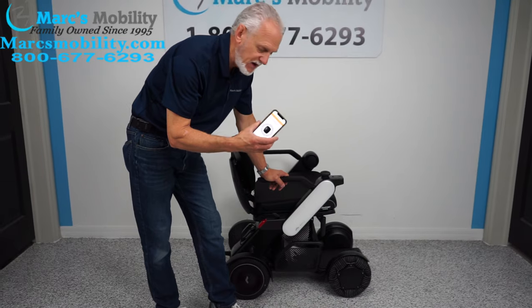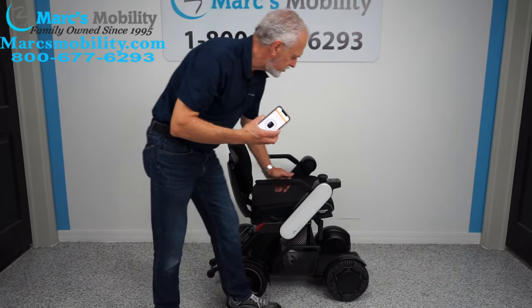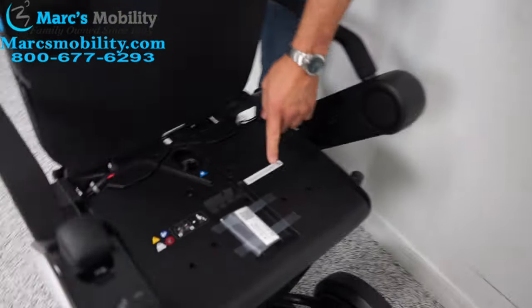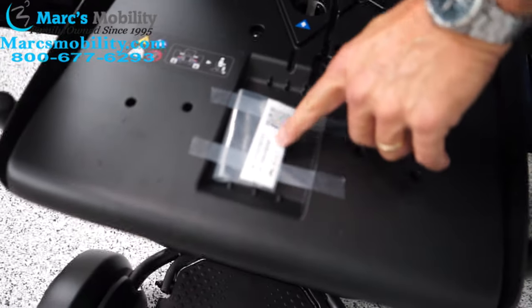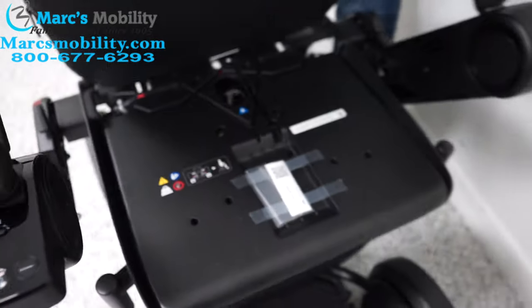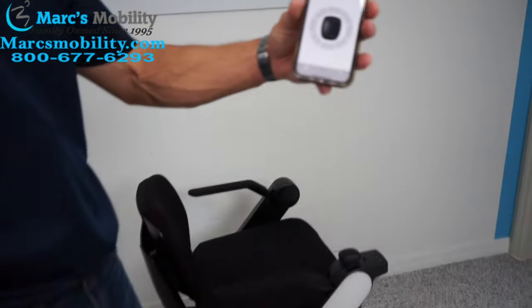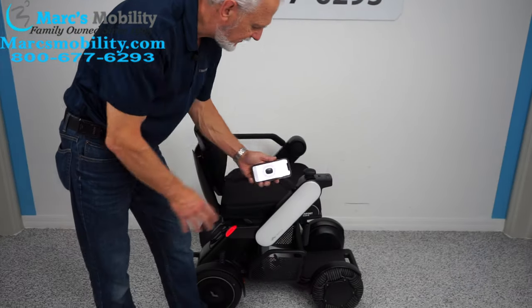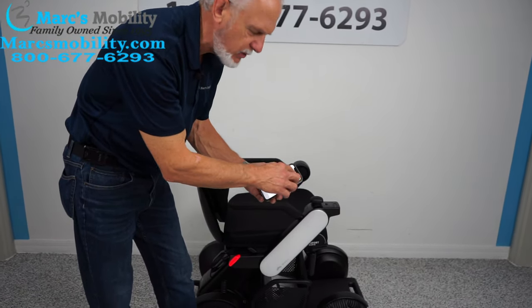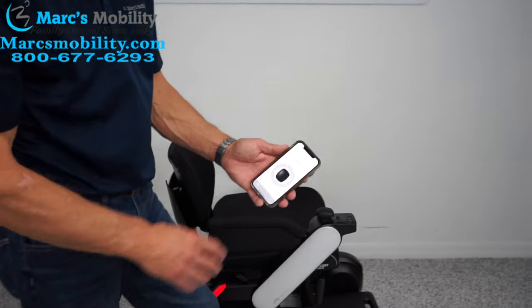If you want to drive this chair with your cell phone, you'll download an app. There's a code number under the seat — a sticker sitting in a square under the cushion — and you enter that code into your phone. If you lose your connection on the app, just hit reconnect and you're right back to it. The joystick is ready to go on your phone.